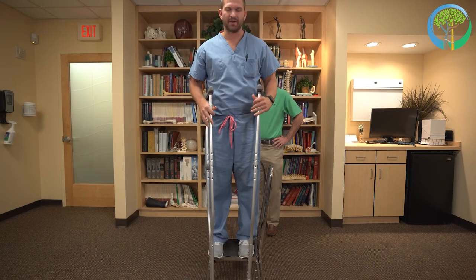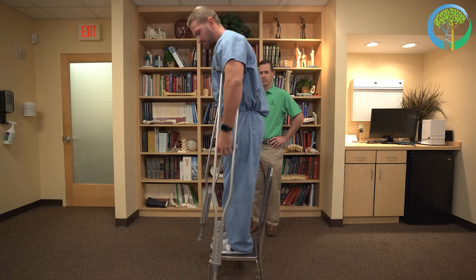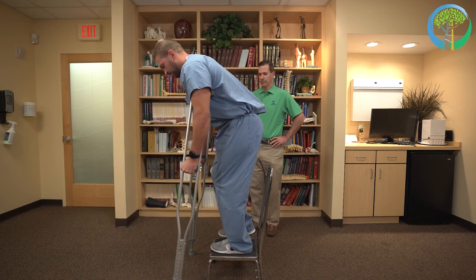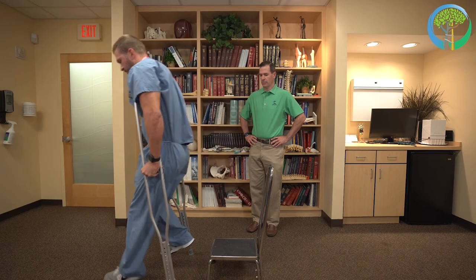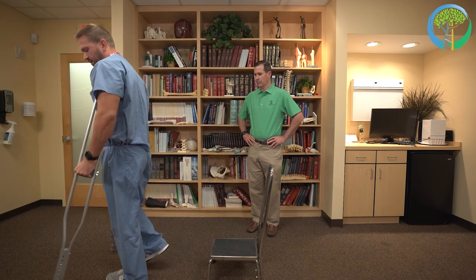Now demonstrating going down the steps. With the right leg as the injured leg, put the crutches ahead at the level below, then lightly push off of the uninjured leg, swing through, and land on the level below with the uninjured leg.